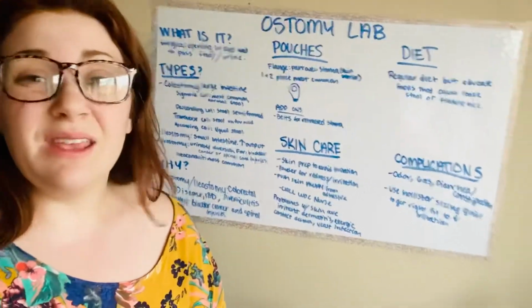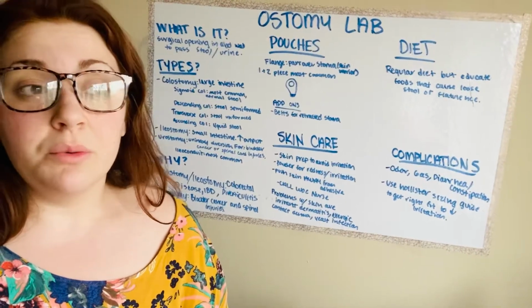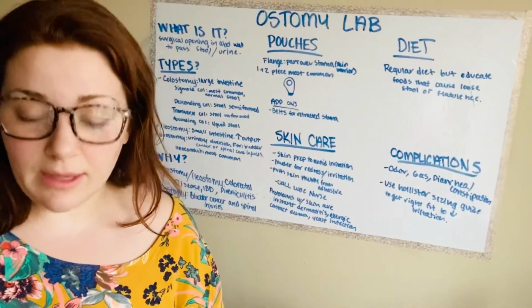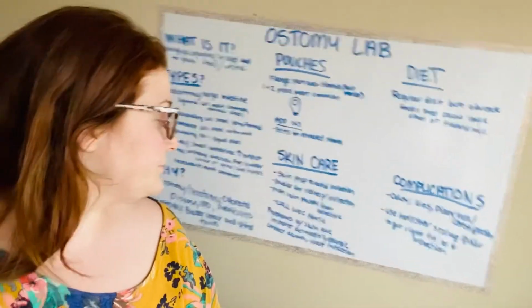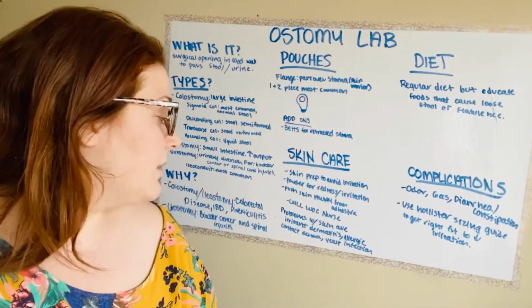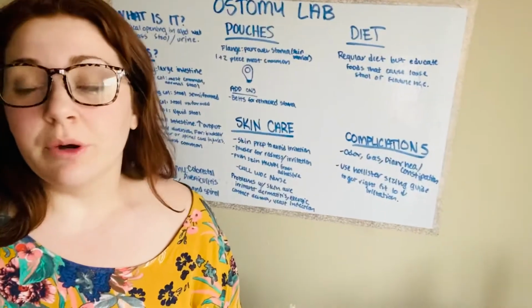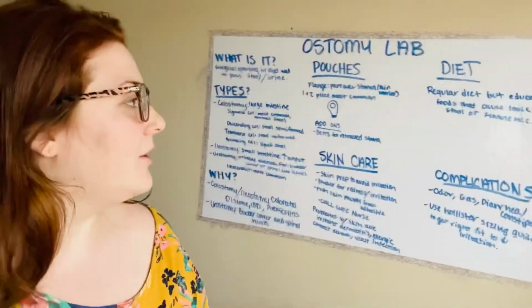And if there is any further problems, you're going to want to call a WOC nurse, which stands for wound ostomy continence nurse. When you're putting on any stickers or any patches, you want to pull away from the skin to reduce irritation. Problems with the skin can be irritant dermatitis, allergic contact dermatitis, or yeast infections, which is why you want to clean that peristomal skin with just a warm washcloth.